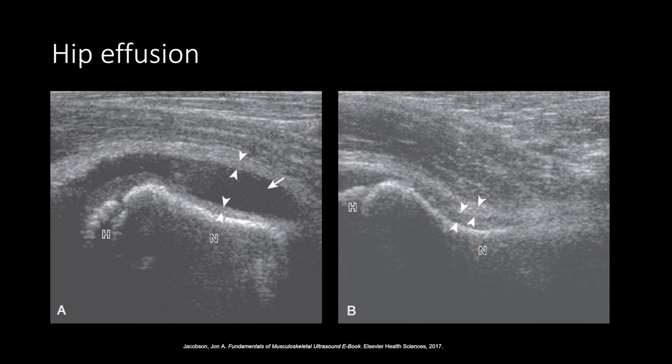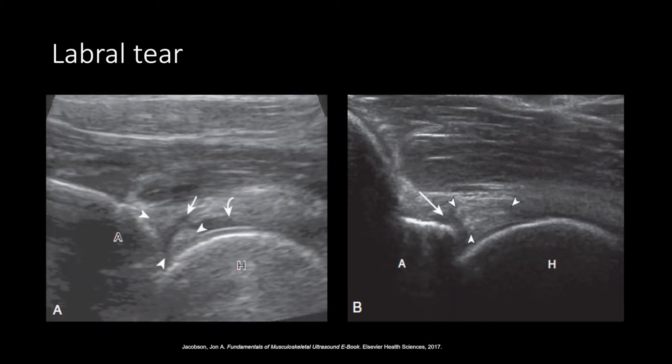Here on the left image, we have a long axis view of the proximal femur with fluid in the anterior joint recess. On the right image, this is the contralateral hip, which is normal with no effusion. These are long axis views of the femoral neck. The left image shows an anechoic cleft, denoted by the white arrow, at the hyperechoic fibrocartilage labrum indicating a tear. The curved arrow shows a small joint effusion.